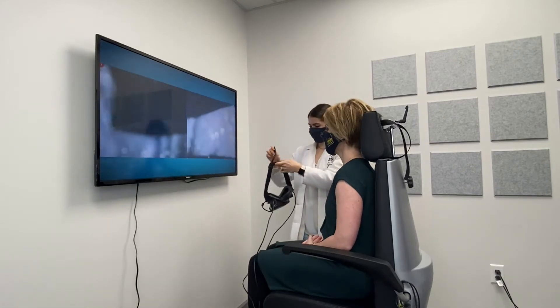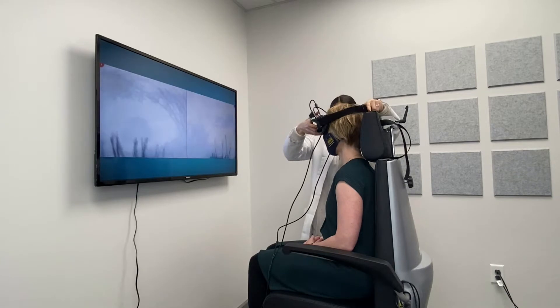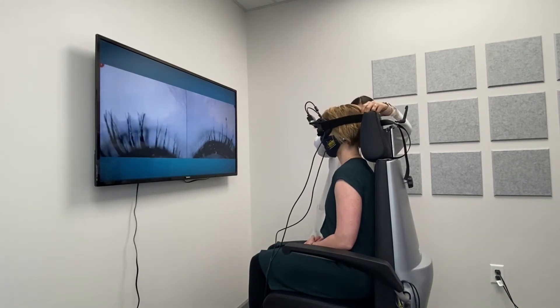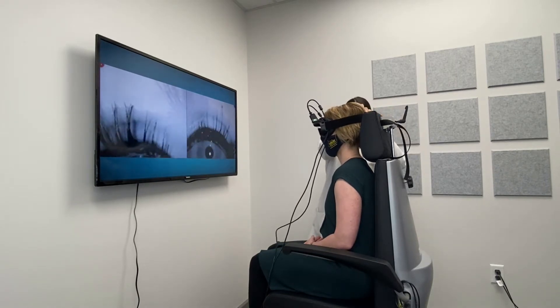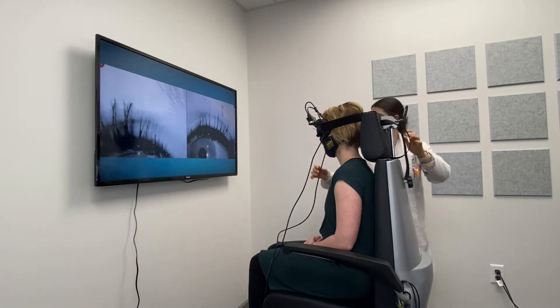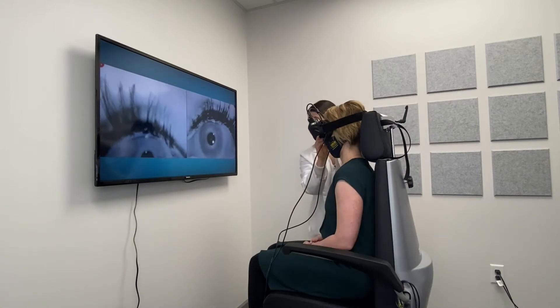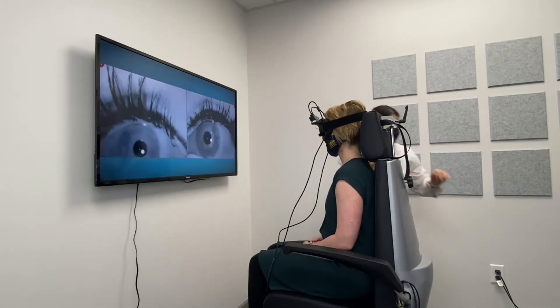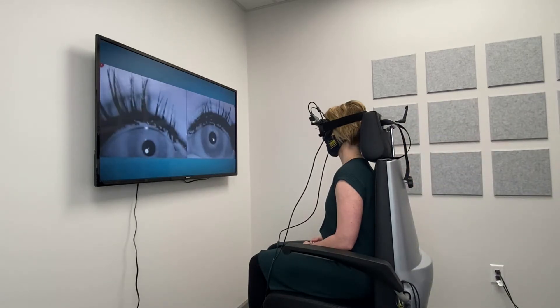Here we are in our vestibular suite. Rachel, who is our resident this year, is going to be helping us through this video. She's just getting Carly set up and fitted with the goggles — the Frenzel goggles that we use in order to take a closer look at the eyes. Everything we do is through video, that's why it's called video nystagmography, and what we focus on is the pupils of the eyes. You'll be able to watch Rachel center up the eyes here in just a second.